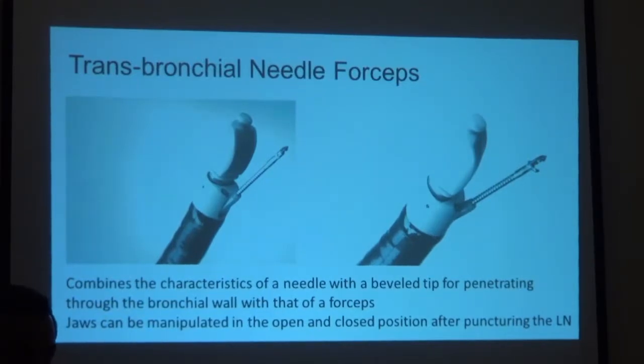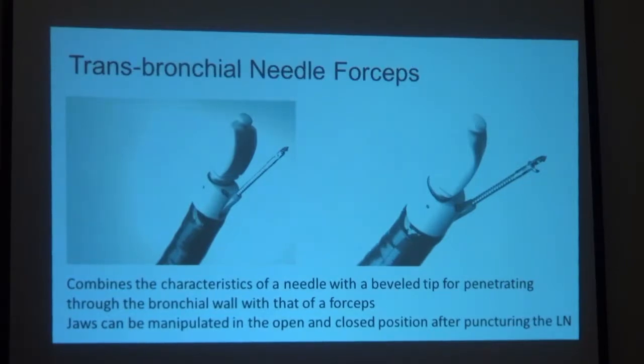This is just an image of the prototype that I'm only aware of a publication about. I don't know anyone who uses it. Before this came up, there was also one study where they actually used a pediatric forceps. They started with the needle: they do their puncture, they go to the lymph node, they puncture the bronchial wall with the needle. And then they introduce a separate mini forceps, a pediatric forceps, through this wall.